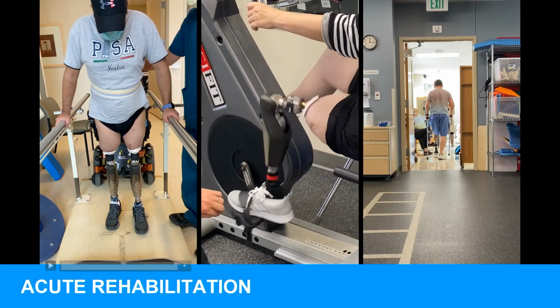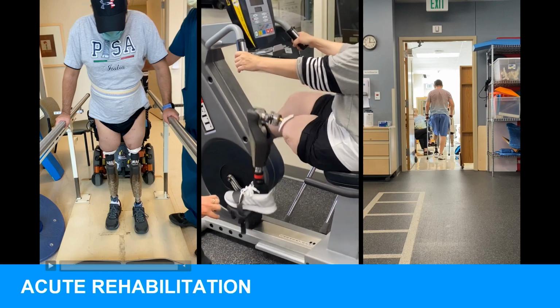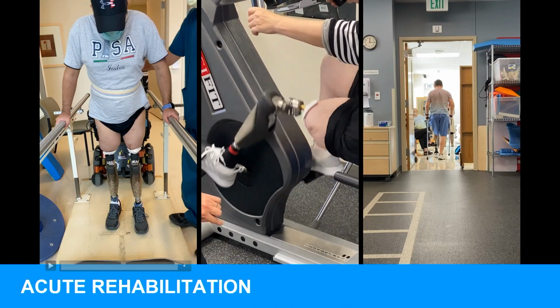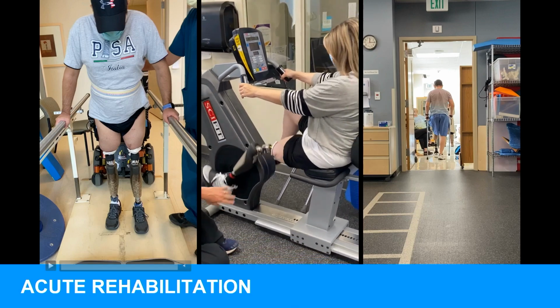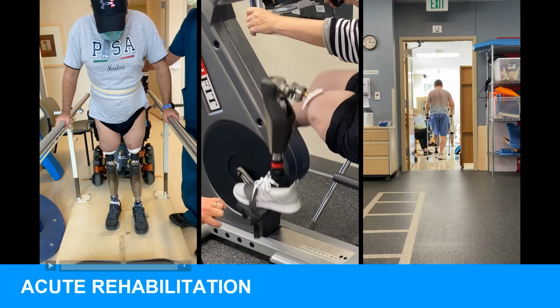And it's amazing to see their progress in 3 weeks. But they leave us with bilateral crutches or bilateral canes in either a 2 or 3 point gait, and then we send them back home to you. And it's really important to continue this process. We communicate closely with you.